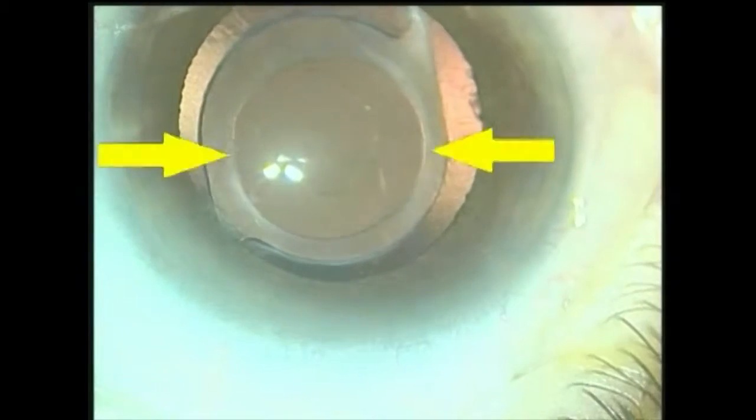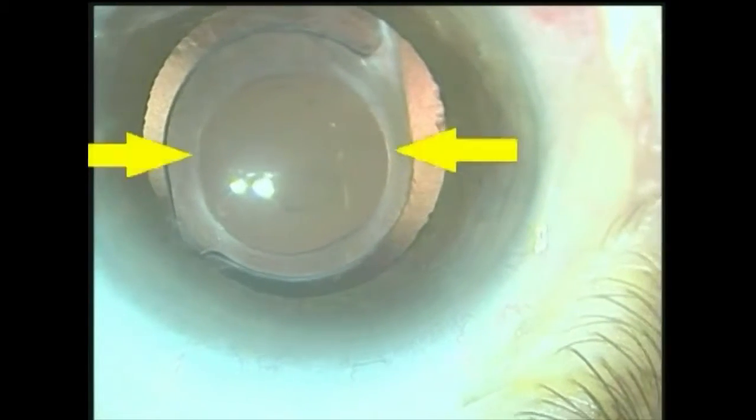When we compare it with the fellow eye that had a silicone IOL implanted, we could notice a much larger space between the IOL and the pupillary aperture. She underwent YAG capsulotomy on the assumption it was the cause of her symptoms, which unfortunately persisted.